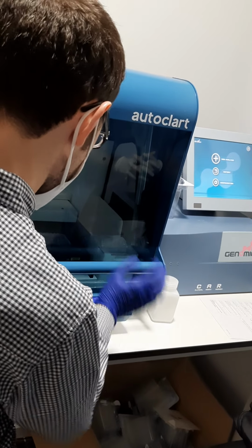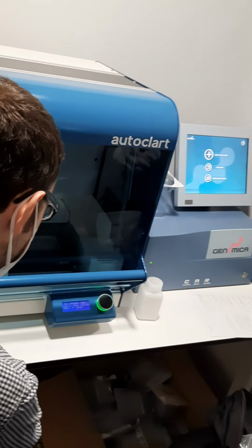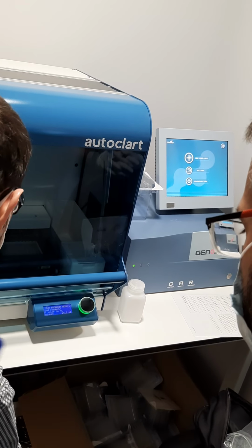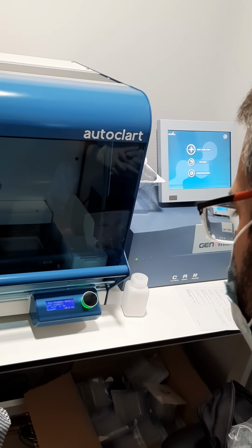So we check that everything is okay. We load the water. We leave water in the TL, and we load water in the SH.